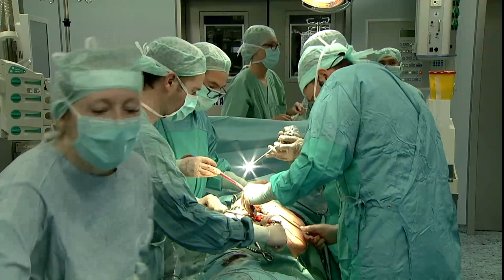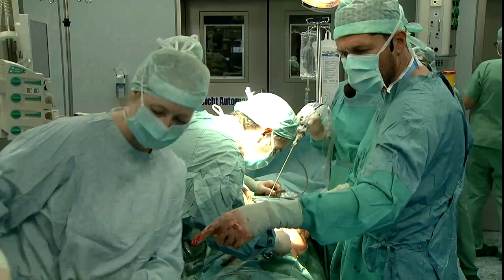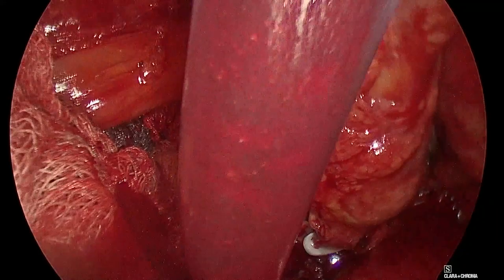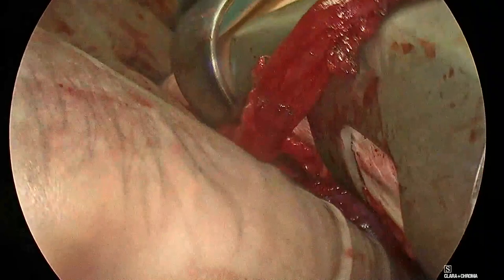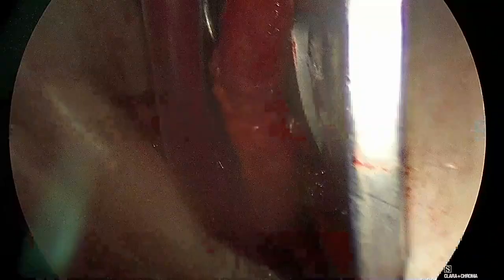Is the patient a fatty patient, Alberto? Yeah, I don't know, she has had something for sure. Can I have a wet gauze? And the fact that I don't have a good retraction is not because of the assistance, it is because this retractor doesn't go deep, and I cannot separate the bowel nicely or the things that I'm used to separating in a normal way. But we will see. We are certainly there now.